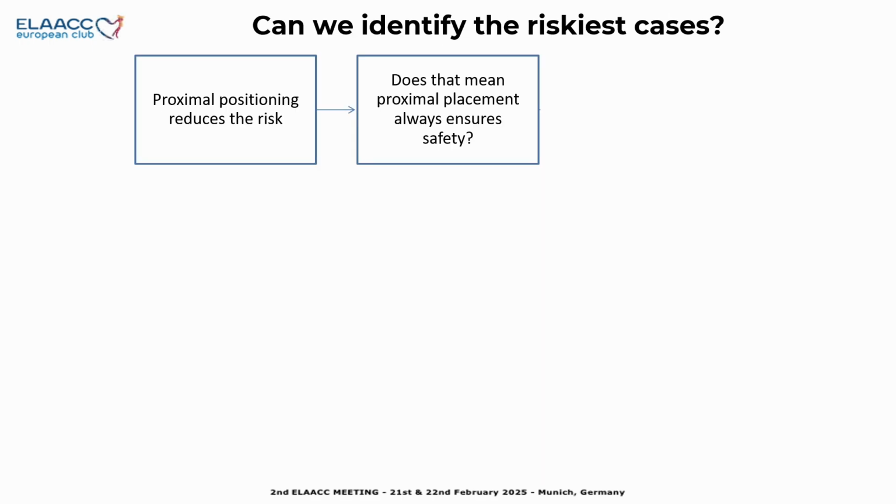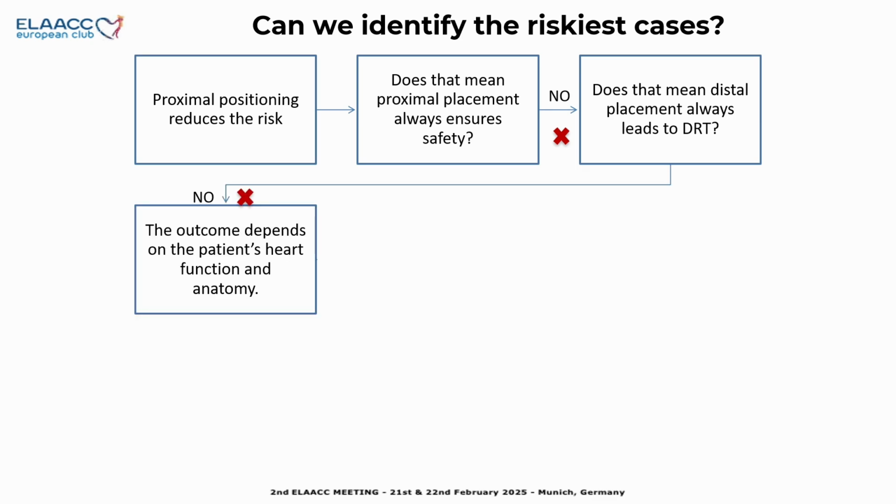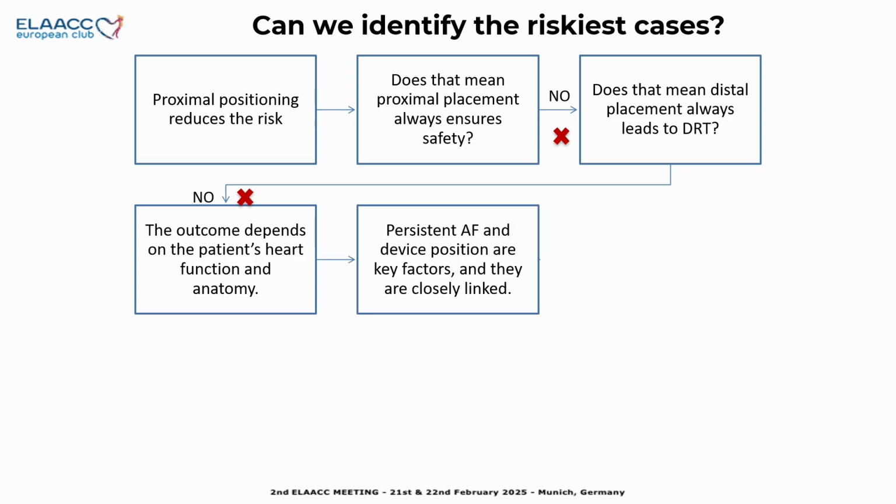What I want to show with this battery of cases is that we have seen in the IDEAL study that proximal positioning reduces the risk, but I'm not saying that if you place it proximally, you will be safe. Also, I'm not saying that if you place it distally, you will have a DRT, not at all. What I'm saying is that, unfortunately for us, this is much more complex. You have to take into account how healthy the left atrium of the patient is, and other key factors such as the position and also the hypercoagulation state of the patient.